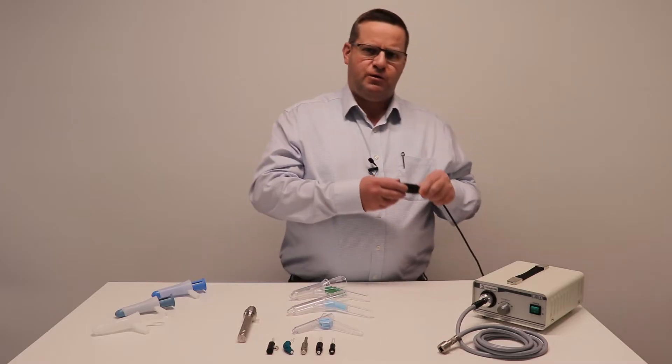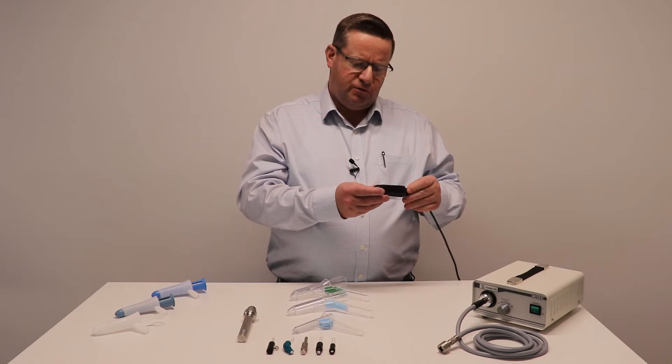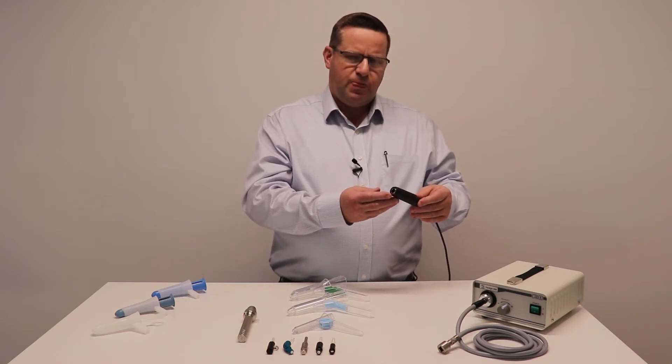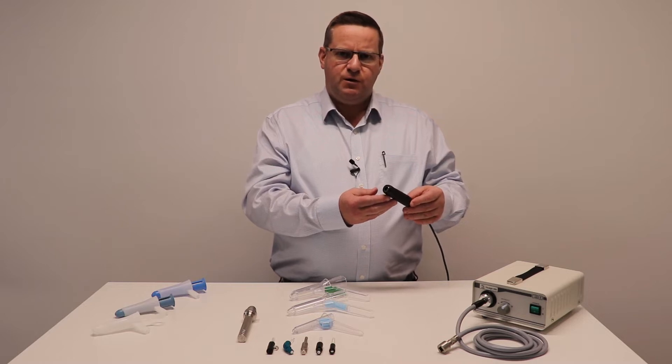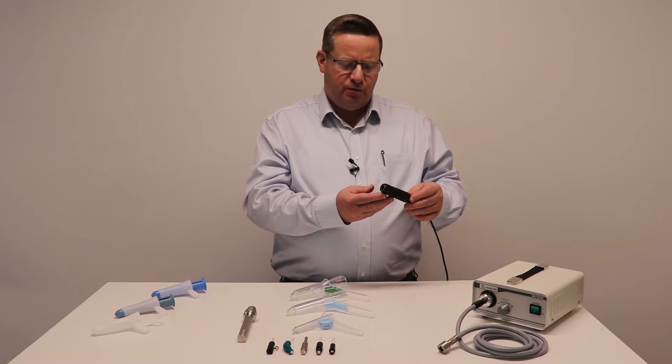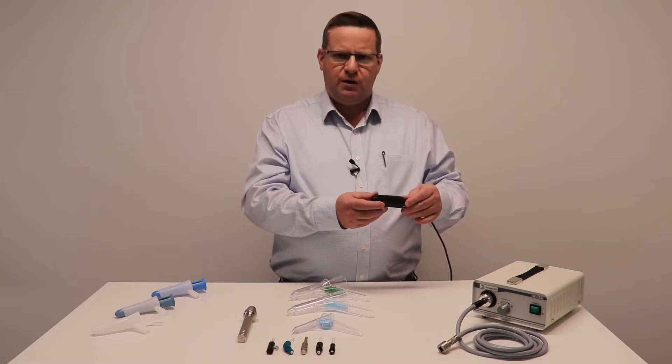One very well known system that's been around for many years is the Welsh Allen illuminator. This is quite old technology now — it has a six volt halogen bulb. Nevertheless, there are many of them still in service and they are still available.